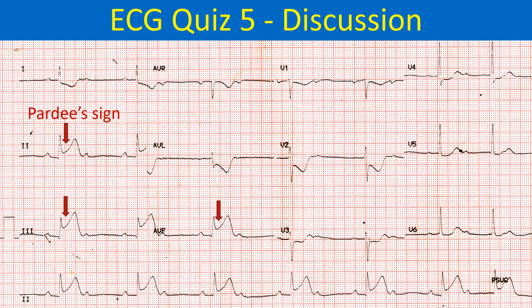Hyperacute inferior wall infarction is evidenced by the prominent upsloping ST elevation in the inferior leads 2, 3, and AVF with upright T waves.